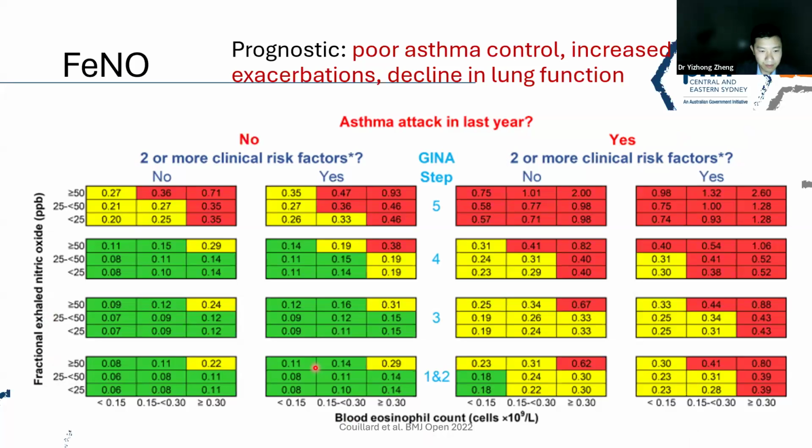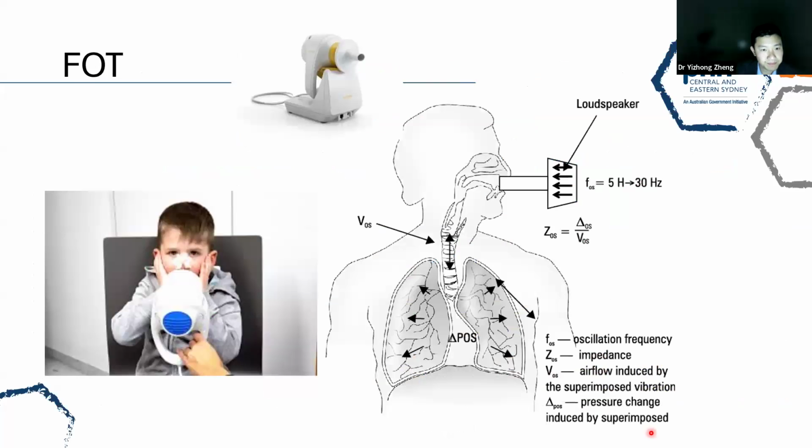So quite useful in the asthma population. It's not something that we do once. We do it upon follow-up in patients that need to be closely monitored, particularly in our severe asthmas.